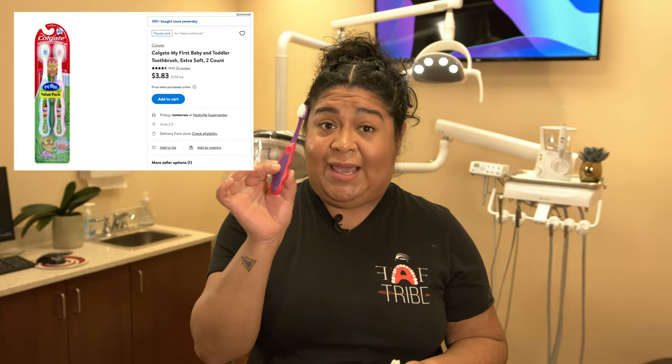The first few days, possibly even the first few weeks, you will only be using a baby toothbrush, because an adult toothbrush is a little too rough on your gums that have been freshly worked on. Make sure that you're only using a baby toothbrush in the beginning while you are healing.